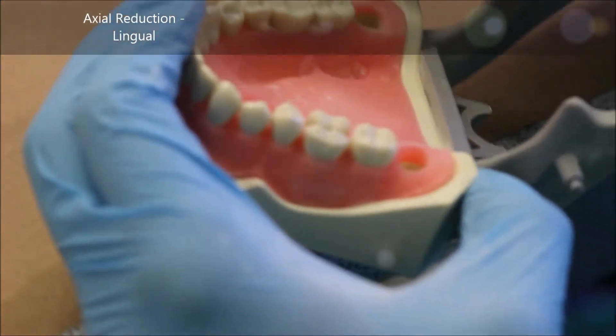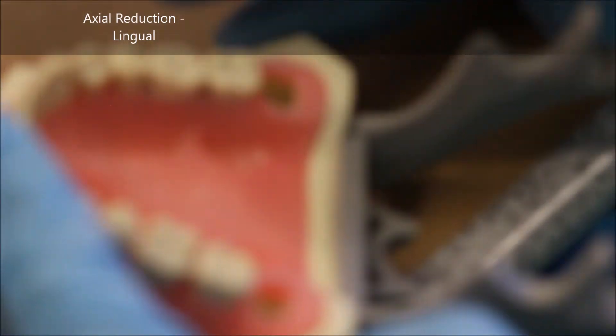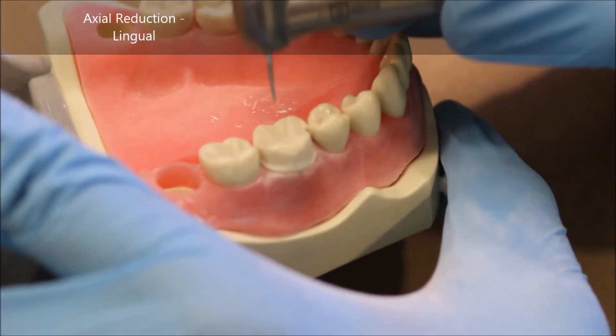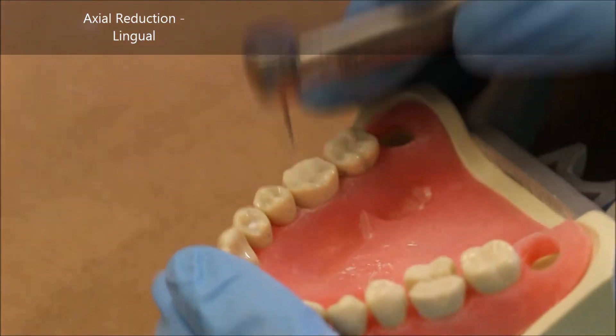Now I switch back to the 878 because I'm making the chamfer on the lingual side of my number 30. Again, we have to check draw, so make sure that your burr angulation is appropriate.